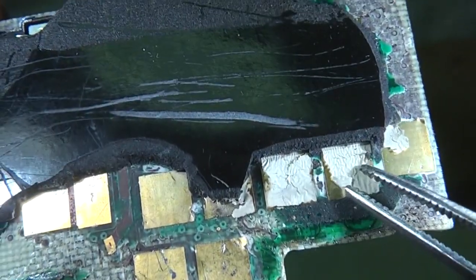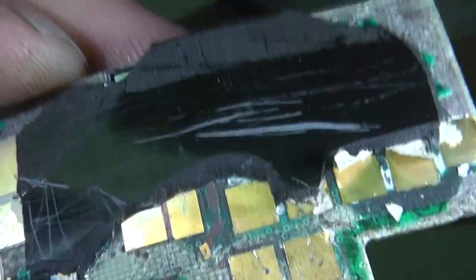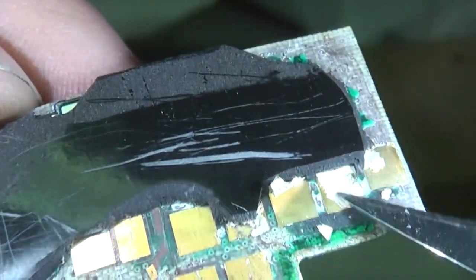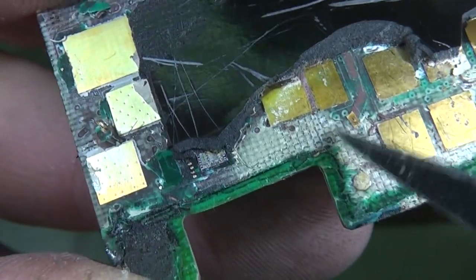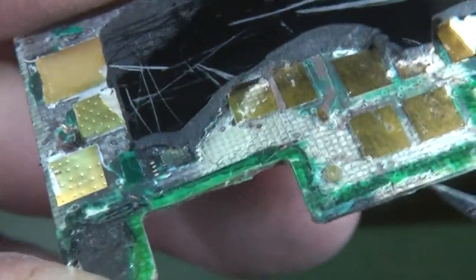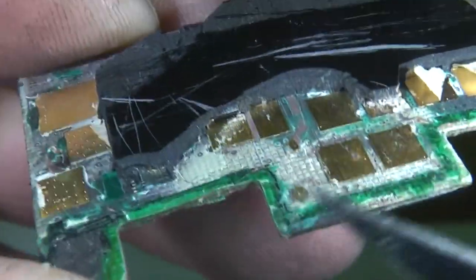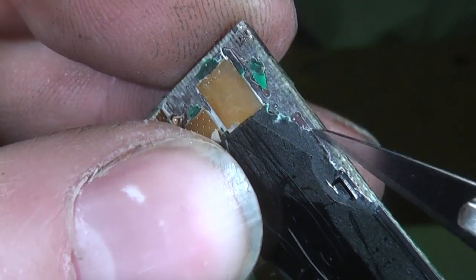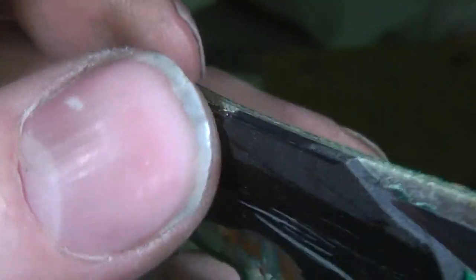And there seems to be this sort of thin material. There's these sort of substrate pads. I'm not totally clear whether this, I think this may even be the top layer of the PCB material. You can see here, for example, you can actually see the weave of the fiberglass material where the top layers come off, but because the epoxy stripper has taken off a lot of it, it's mostly the PCB it's taken off rather than this epoxy, so that when I crack a little bit off of here, I think it's tending to take the top layer of the PCB off with it rather than just crack the epoxy.